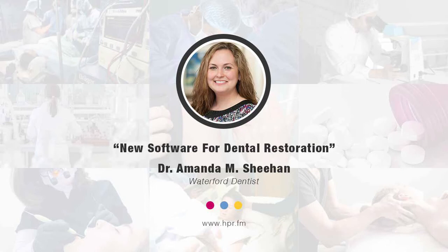Oh no, it's used for that as well. The beauty is, the most difficult thing to do in smile design is to get the two front teeth to match. You need a very talented ceramicist who can do all the fine details with the color and with the shape. Now with the computer, we make a mirror image and we copy and paste. So there's no, this looks off a little bit, because they're identical.